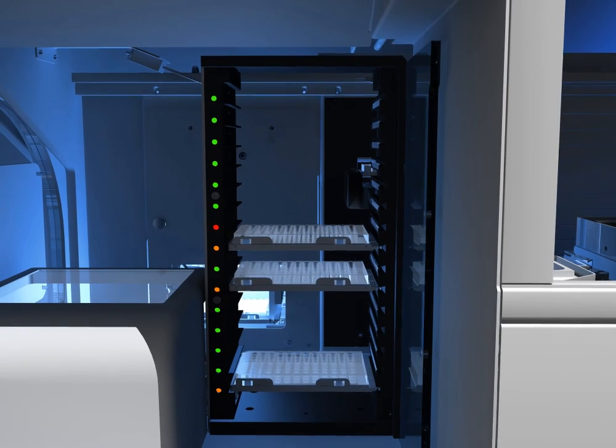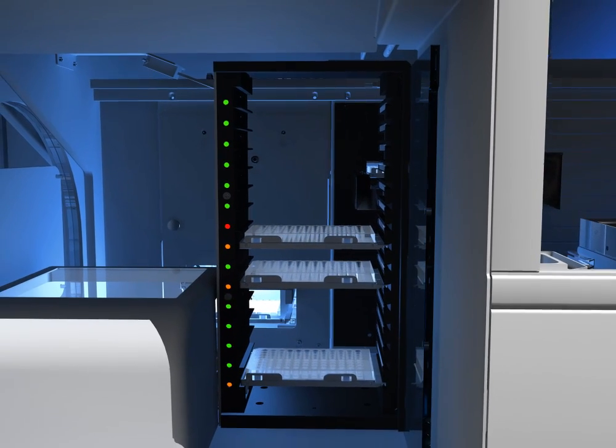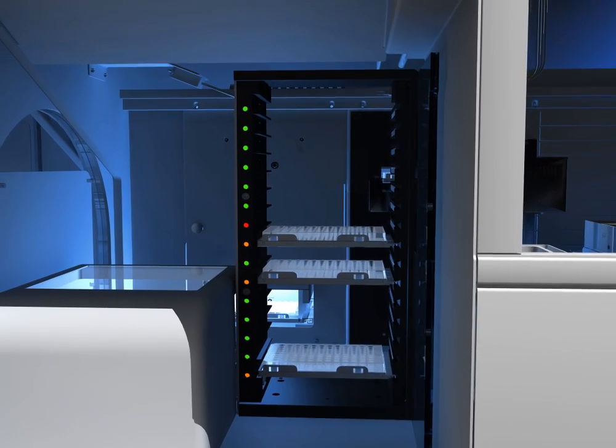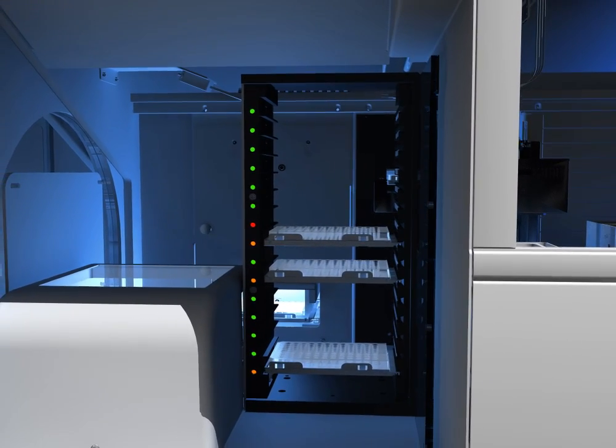The microplate loading tower features LEDs to guide the operator in resource management.